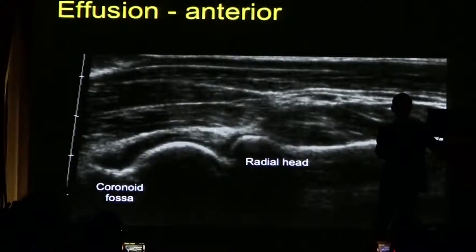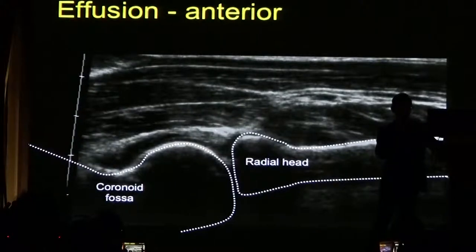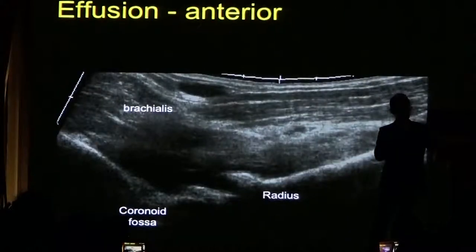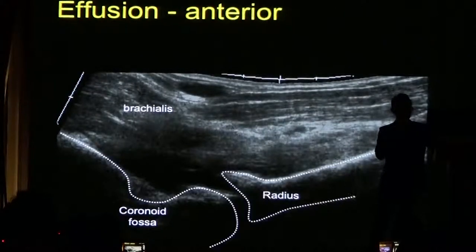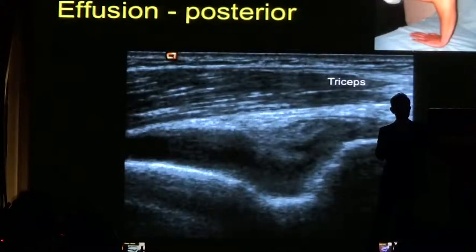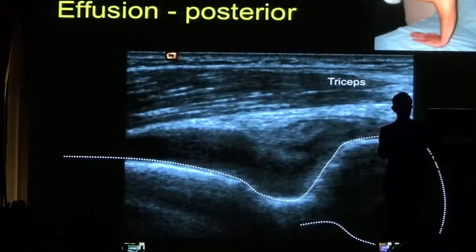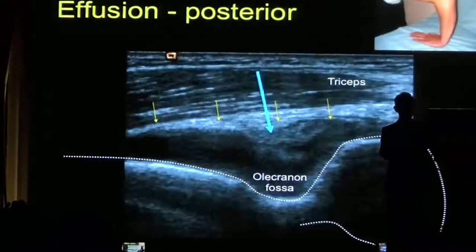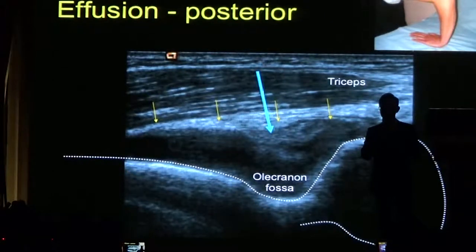This is an anterior view showing the radio-capitella joint. The arrows show the hypoechoic effusion present anteriorly. Here is another effusion, with the bones outlined and the arrows pointing towards it. Posteriorly, we can see that the olecranon fossa normally has fat within it, and that fat pad has been displaced by fluid in the joint. The posterior approach is the safest place to perform an aspiration of the elbow joint, because there are no important structures here to damage.